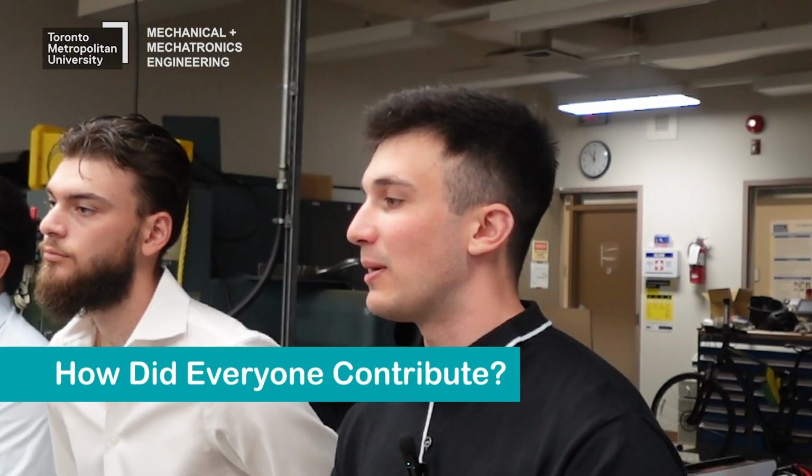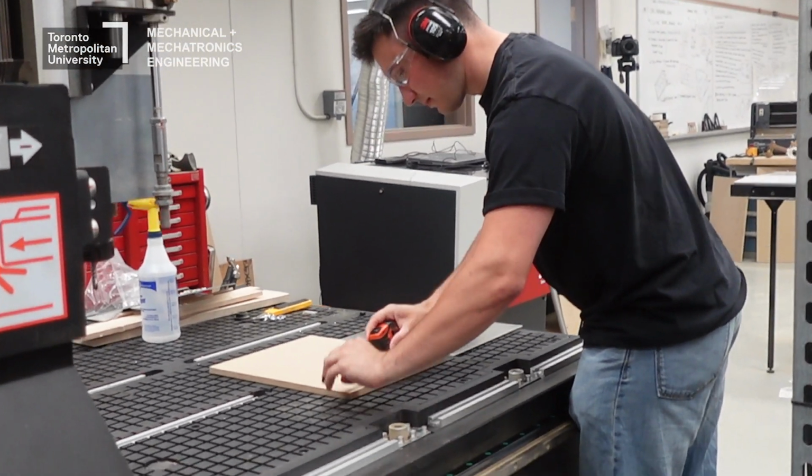Coming from different backgrounds, myself and Juneal and our other fourth member, Dylan, are all mechatronics. Ethan is mechanical. So from our side, we have a bit more experience in computer and electrical engineering topics, so we took that side of the project. Dylan specifically was our project lead. He was the project manager, making sure we were on time, we were getting the parts that we needed, and he oversaw everything. Myself, I handled the main design of the device. I made all the CAD for the device, all the mechanisms and how everything would fit together. I did all the design work for that.